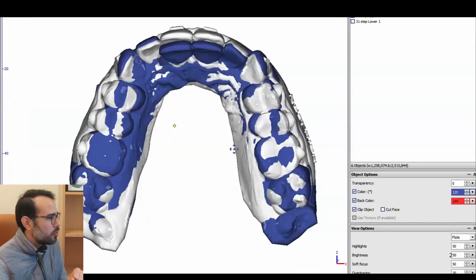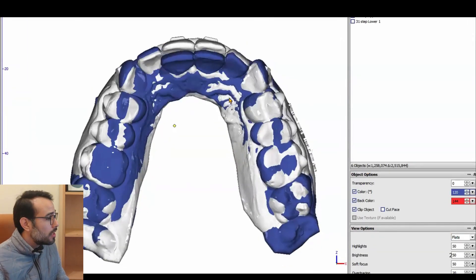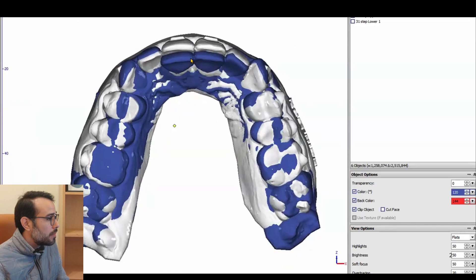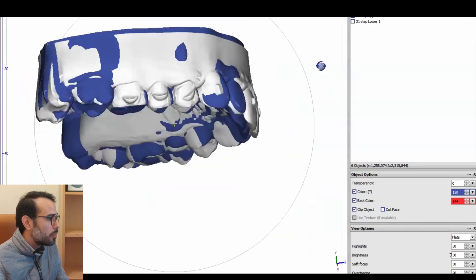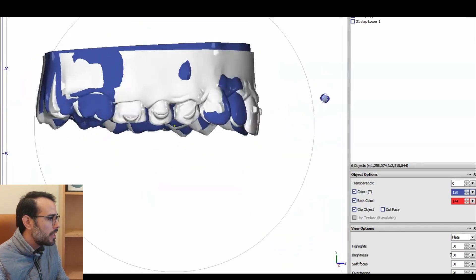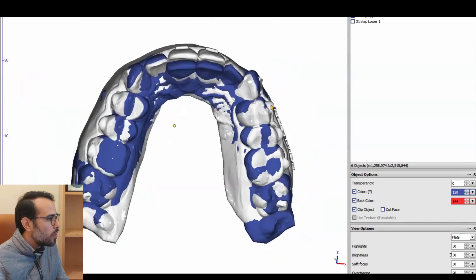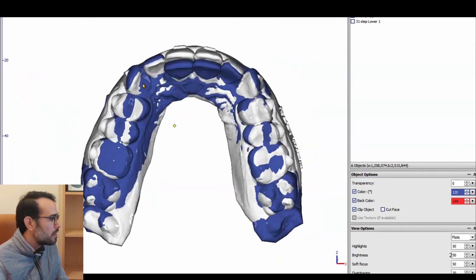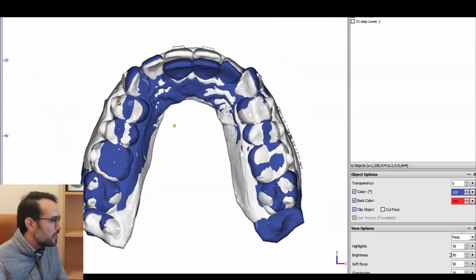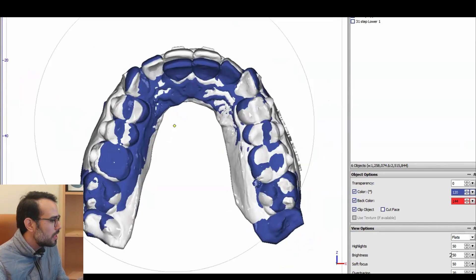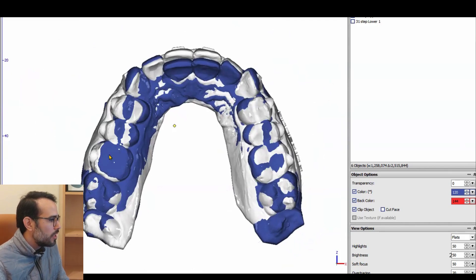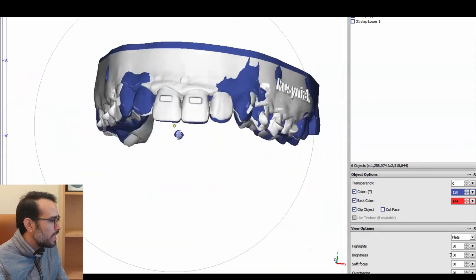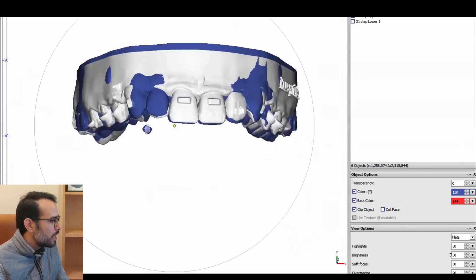I have some superimposition images, which they look pretty good. If you check how the anterior teeth got proclined, it's very nice. You can see the blue one is the initial one and the gray one is the refinement. So we did achieve expansion. We did not achieve 100% of the expansion, but we did achieve some expansion.